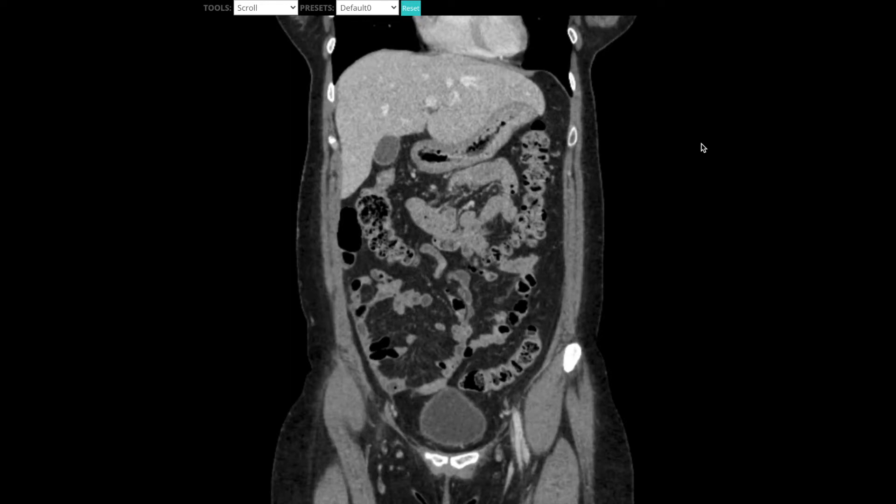In this video, I'm going to be walking you through a very simplified approach to how you read a CT scan of the abdomen, as if this were your very first scan that you're opening up. Whether you're a med student, an intern, a nurse, or whatever it may be, this video is going to walk you through that.